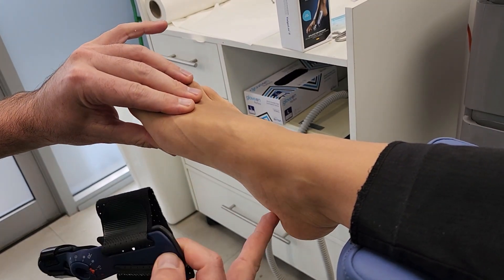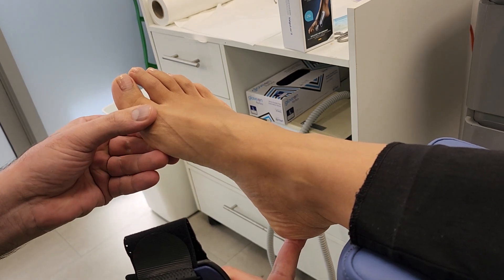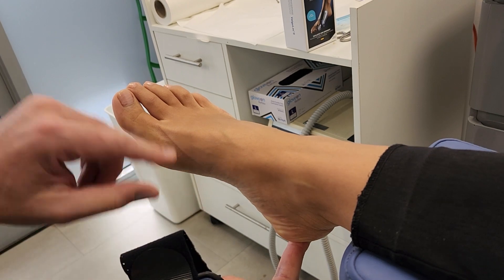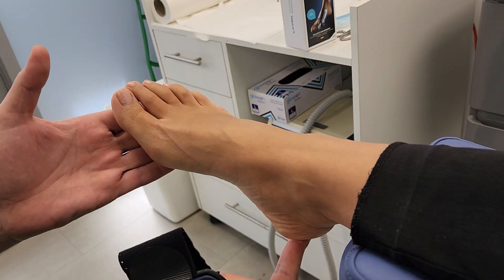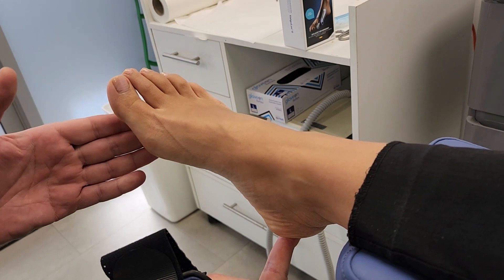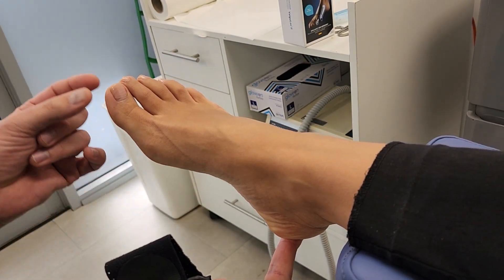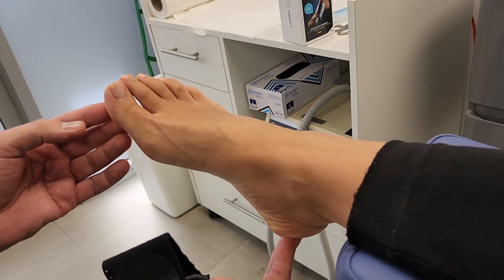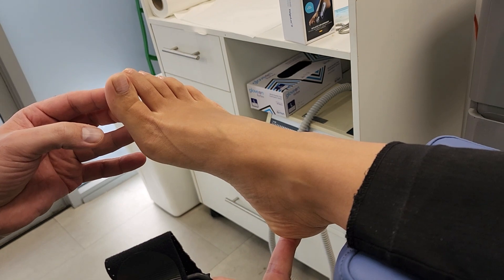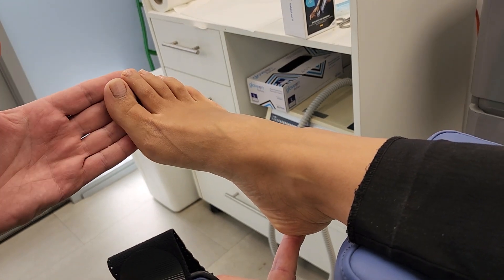I've probably prescribed it about six times now, and the reason being it immobilizes the joint unbelievably well. When you've got an injured ligament or a chondral injury you want to rest the joint. We could do that by putting the person into a cam walker, but that's inconvenient for a lot of people. We could immobilize it with an orthotic and a Morton's extension, but they still bend through that extension — even with a rocker bottom shoe they will still rock off and bend through the joint.